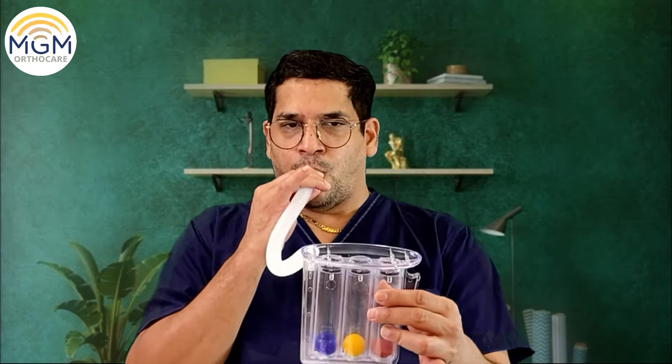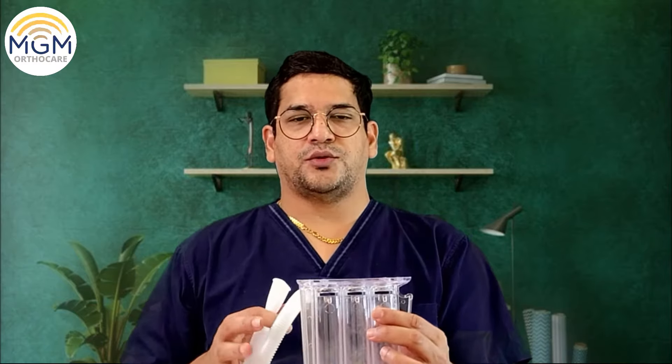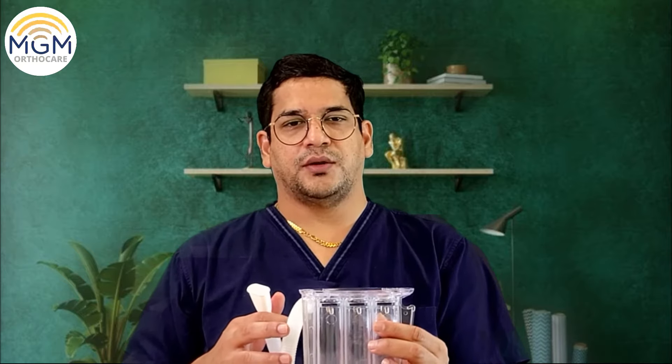Now you turn this upside down and hold it. You have to blow it out — take a long deep breath and blow it out. You saw I could do only two balls going up. Doesn't matter. By regular practice, we can achieve this.